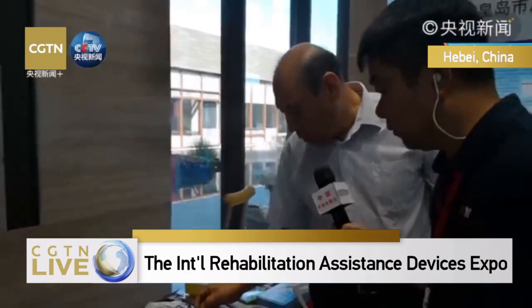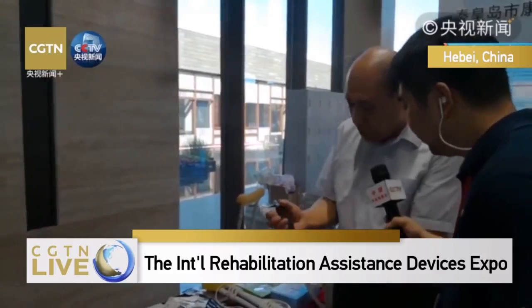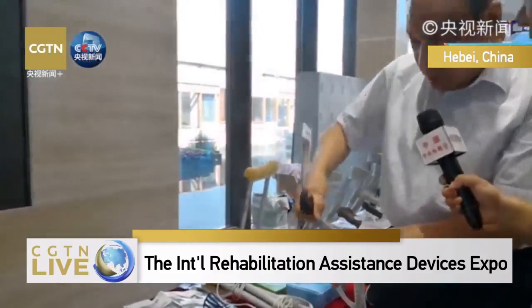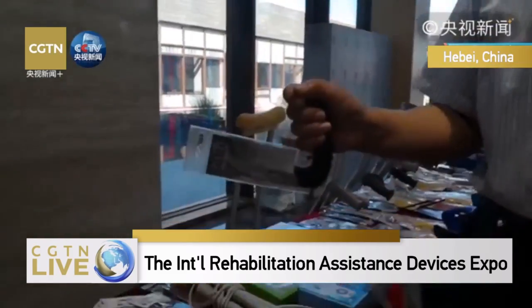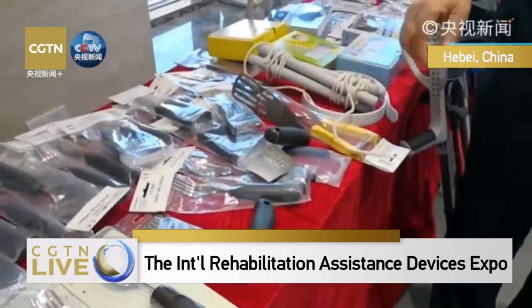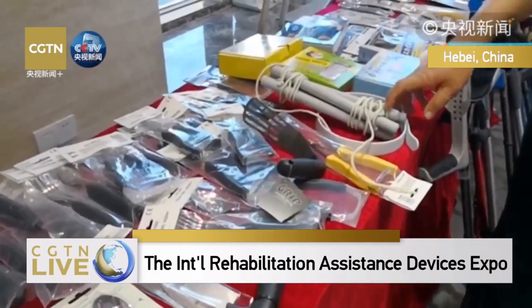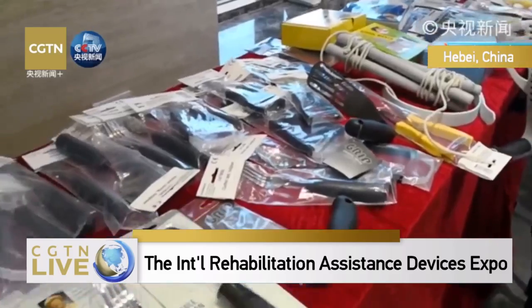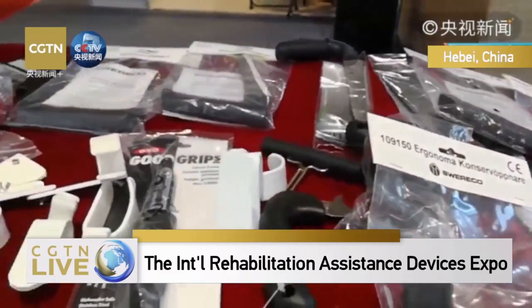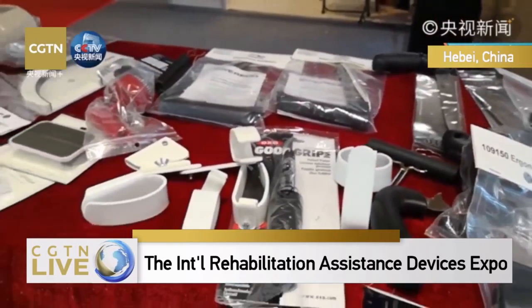These are daily utensils to facilitate people's lives. These are knives. Unlike traditional knives, you can use it this way. So these are all specially designed for elderly citizens.